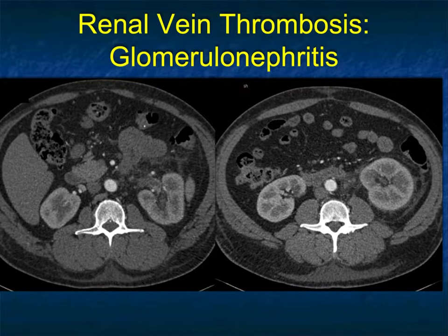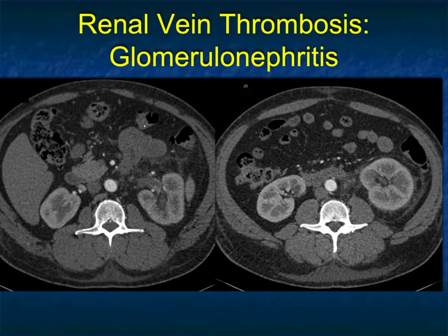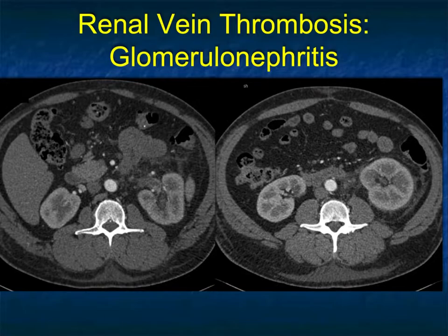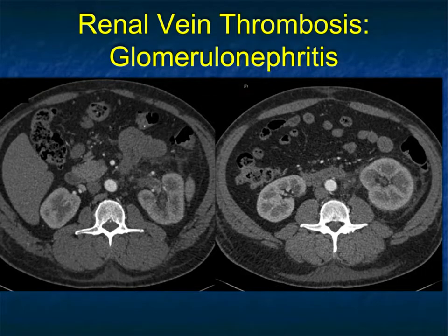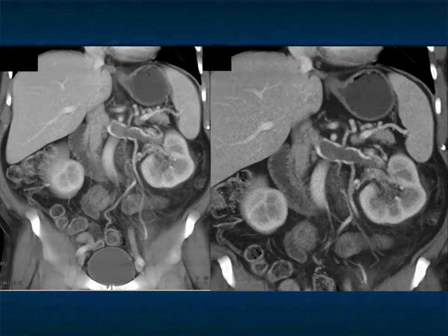One of the things you typically see with renal vein thrombosis is persistent corticomedullary differentiation, as seen here in the left kidney. You'll also see stranding around the kidney, and when you look carefully, the presence of thrombus. It can be seen in the arterial phase, and in tumors — particularly clear cell with renal vein involvement — you may see increased vascularity. Essentially every other cause of renal vein thrombosis is going to be hypodense.